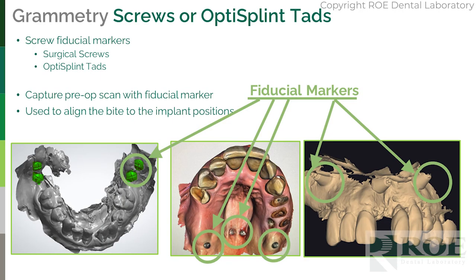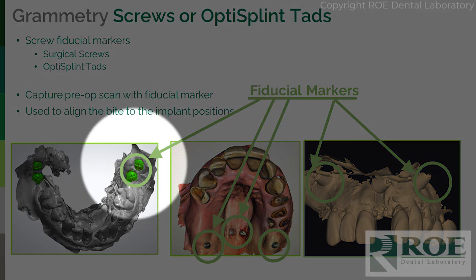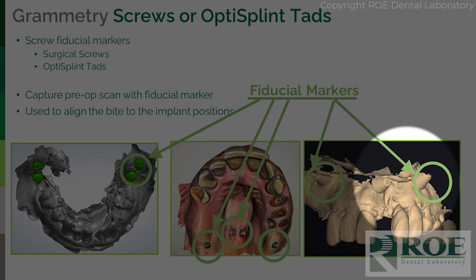Screws or OptiSplint arch tracers, as we call them. This modality is very, very familiar in the marketplace if you've been involved in photogrammetry, if you've used a digital protocol to make restorations. So in this protocol, you will place screws somewhere in the mouth or the photogrammetry arch tracers. You can see these here. We'll have another image of it coming up in a minute.